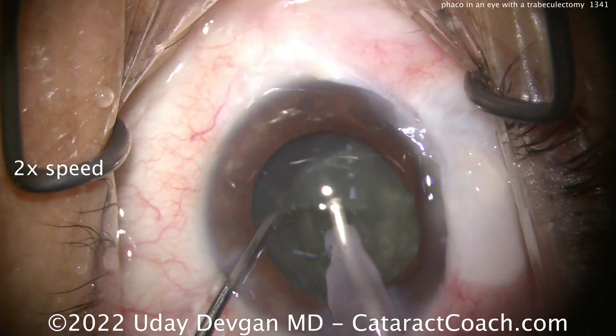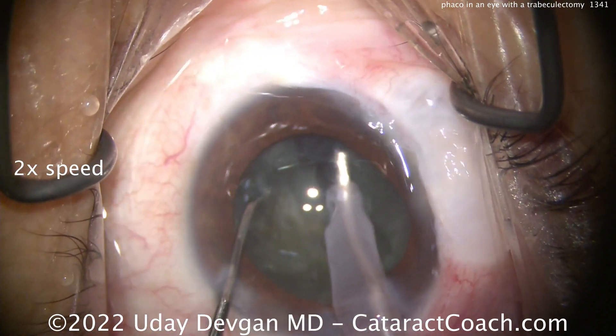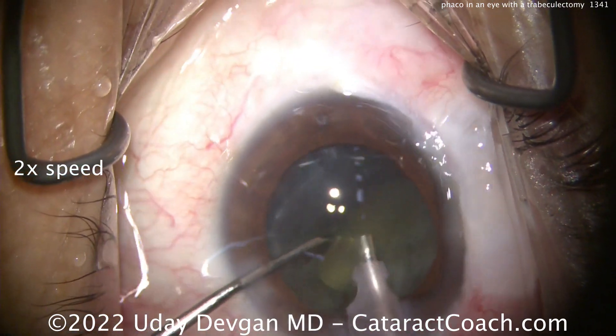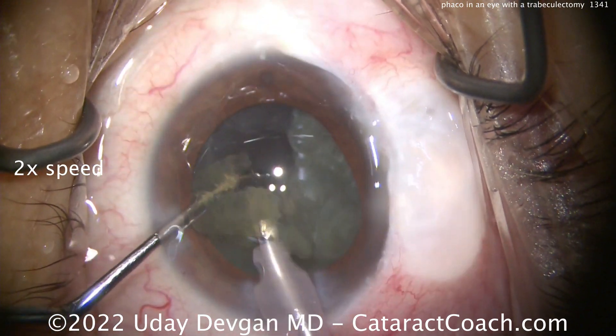Let me show you a real-world, a little bit of a struggle here — trying to get these pieces out of the capsular bag. Maybe that chop didn't fully propagate; we'll try to split it again, getting this chopper around. Not having the hottest success, but I just need one piece. There it is. Once this first piece starts to come up, now I'm going to have an easier time.